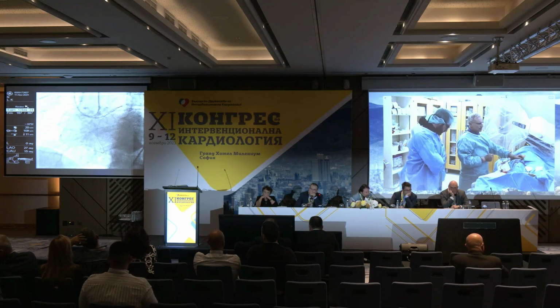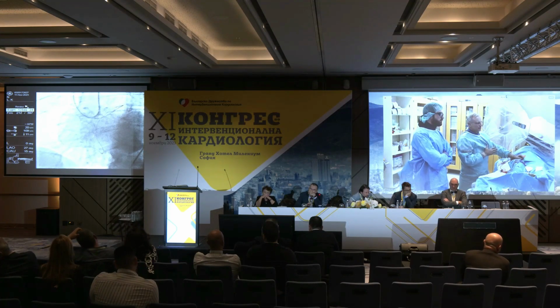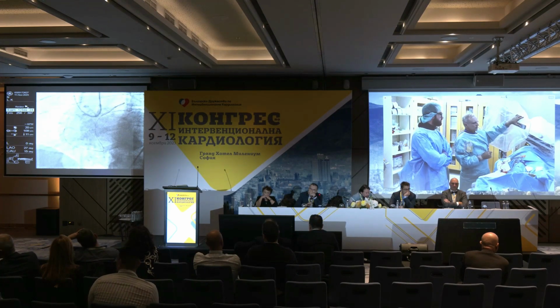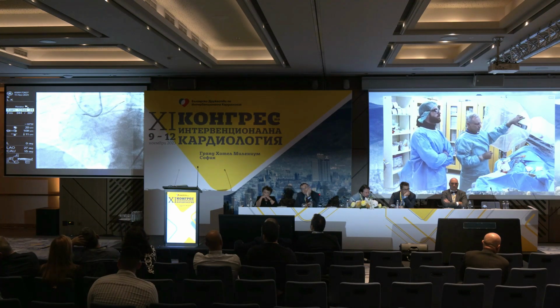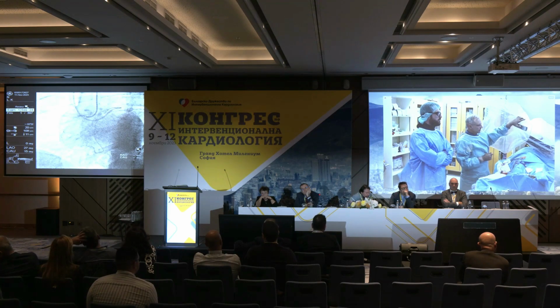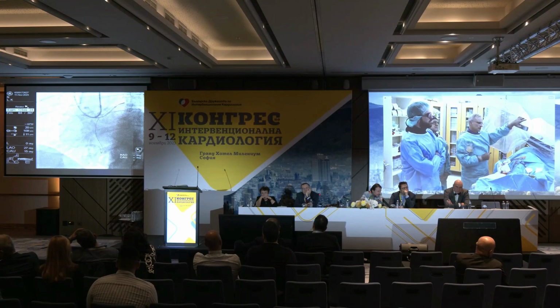So essentially, because you can do proximal cap modification, you can do all of these techniques, they're quite complex. Anyway, I had the feeling that we had chances for retrograde wire crossing, and I changed the wire into a Gladius EX. One of the things that you will see from the details, first of all, see the tracking. It takes a 90 degrees bending before entering the proximal cap, and then you saw that we crossed into the aorta. I'll just leave it for you to see how it's really working.